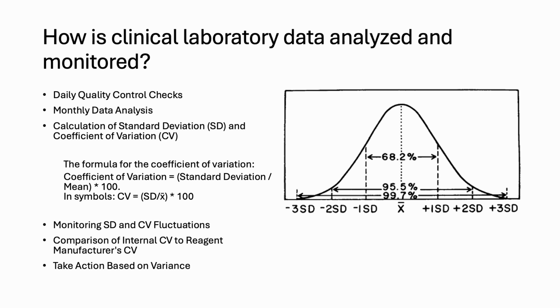Calculation of standard deviation, in short SD, and coefficient of variation, in short CV. Calculate the SD to measure the amount of variation or dispersion from the average control data. Determine the CV as a standardized measure of dispersion, useful for comparing variability regardless of unit of measure.